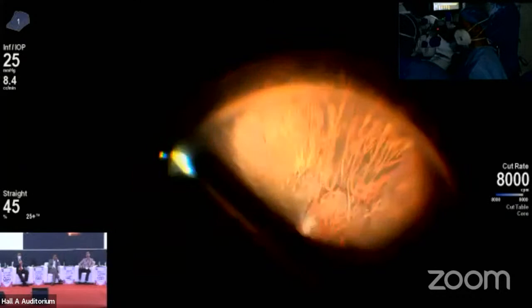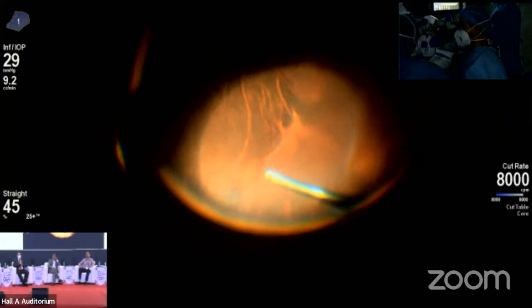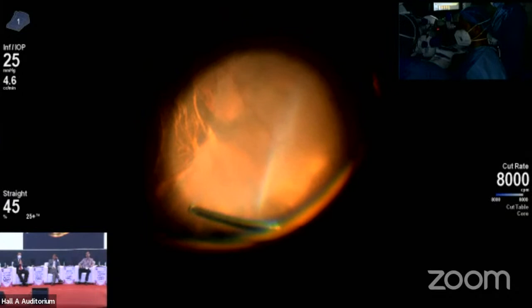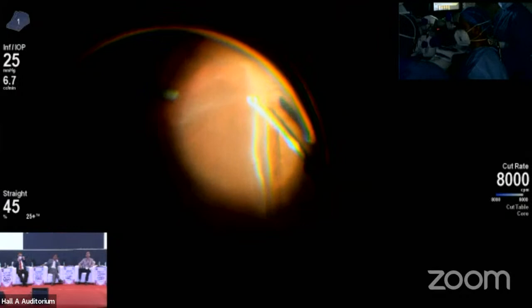So usually in fresh cases, I do not indent and shave the peripheral vitreous. In a short while, when we complete our fluid air exchange, then I'll show you, I'll be doing peripheral vitrectomy under air, that is interface vitrectomy. So if you see, we have removed the majority of the vitreous from all around, only a little bit around the ora serrata is left. So that is in fact the most difficult part to do. Even the tear is free of vitreous now.